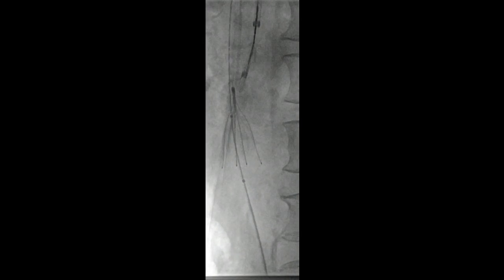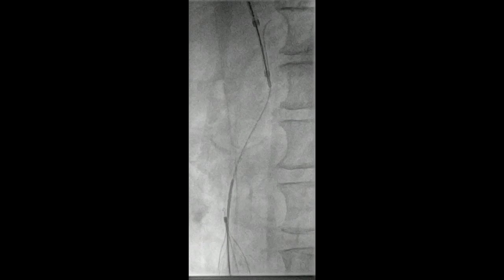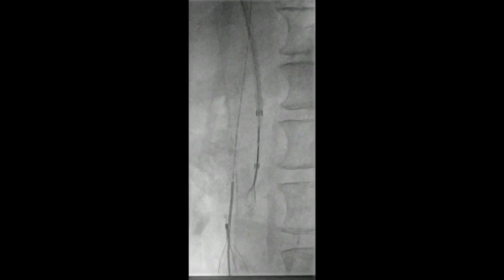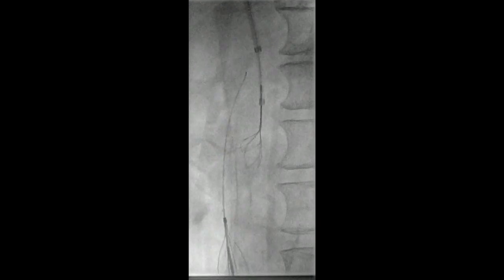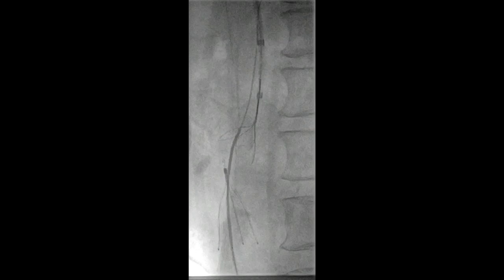This can be rather frustrating. If this is not going to work then you kind of want to go on to the next plan. Here we've snared the wire — now we're actually going to ride the wire down over the diagnostic catheter, but the diagnostic catheter is really just riding around the apex of the filter itself, clearly not in the right position between the filter legs. So this ain't working.